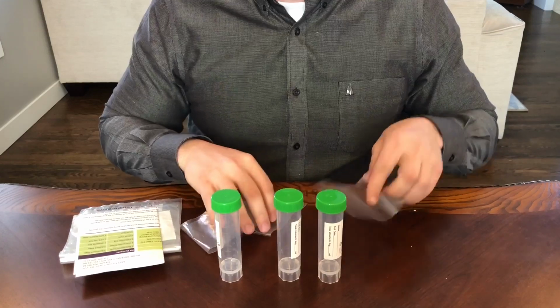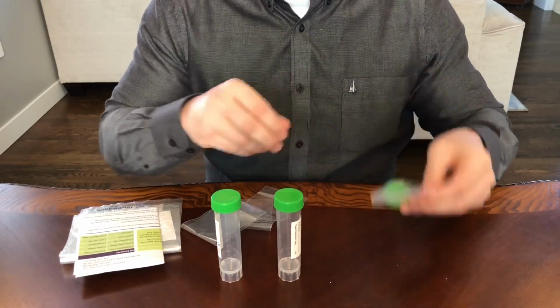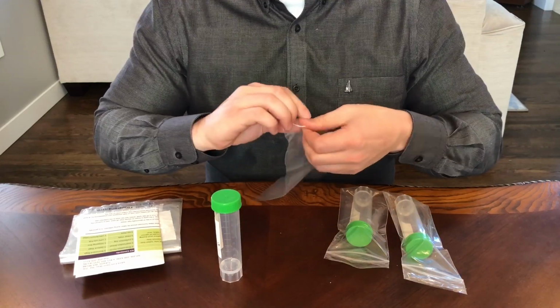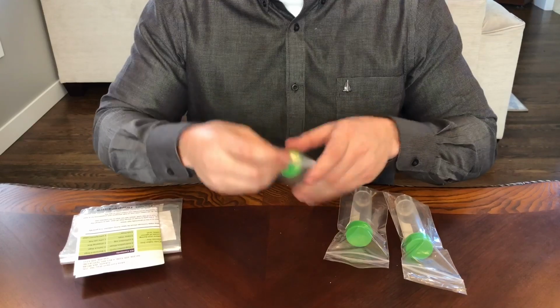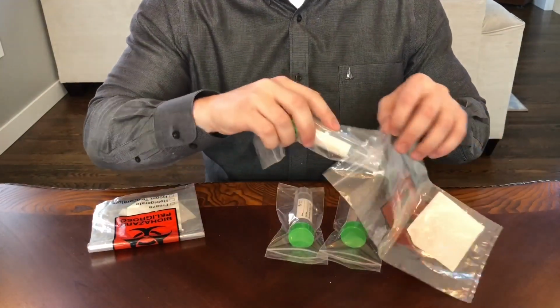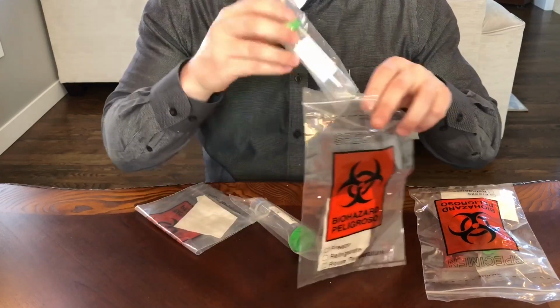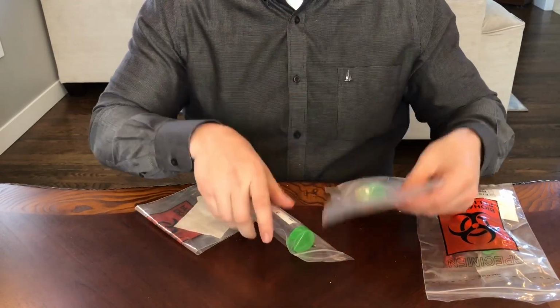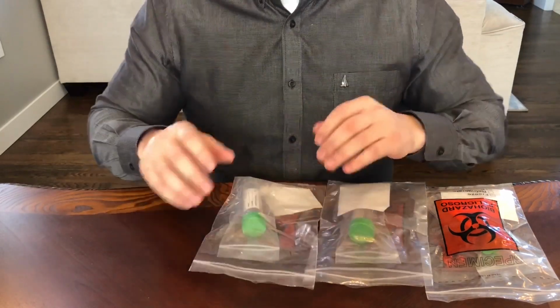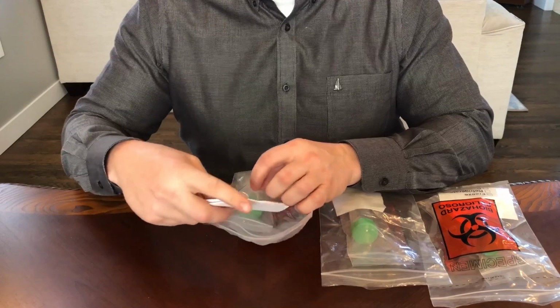Next, you're going to want to place all the vials in each Ziploc bag and seal. Then place the vials in the zippered portion of the biohazard bags. Next, take your requisition form and questionnaire and put it in the outside pocket of any of the 3 biohazard bags.